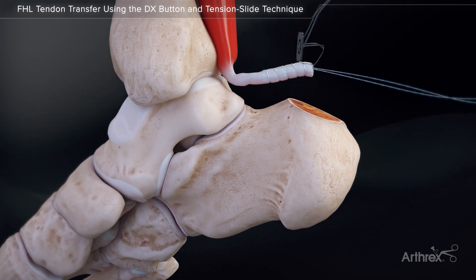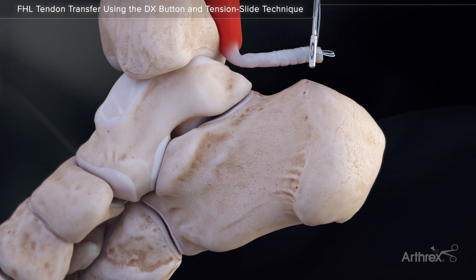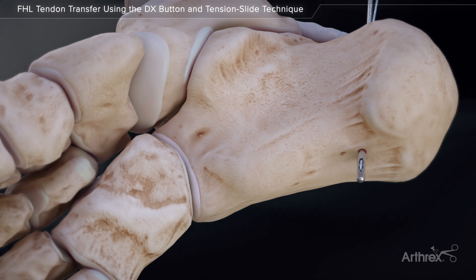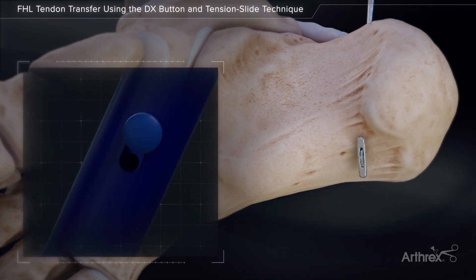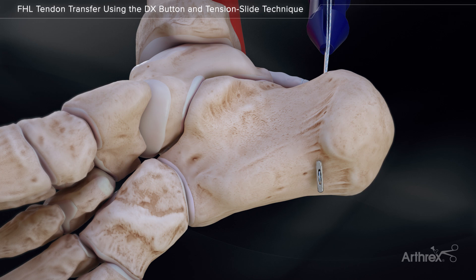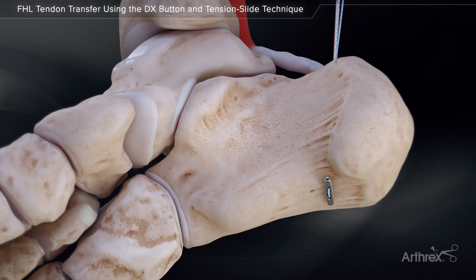Hold tension on the suture limbs and insert the tip of the button inserter into the button. Hold tension on the sutures and insert the button through the calcaneus under fluoroscopy, ensuring it is deployed through both cortices. Pull the lever back on the inserter handle to release the button. Leave the button inserter in the hole when pulling tension back on the button. Pull on the free ends to seat the button against the plantar calcaneal cortex. Confirm with fluoroscopy that the button is in appropriate position, resting against cortical bone. Remove the button inserter.